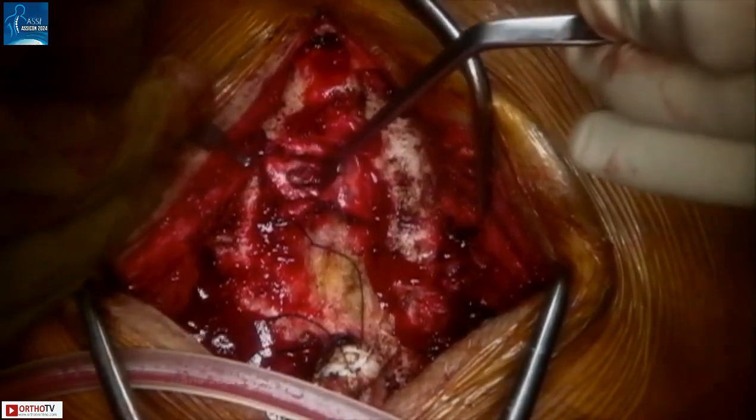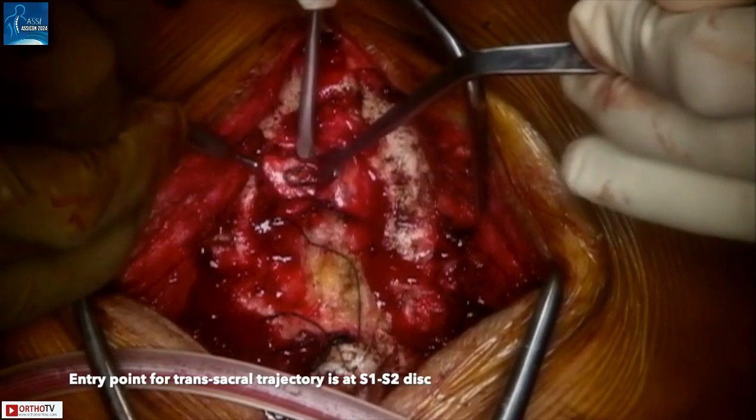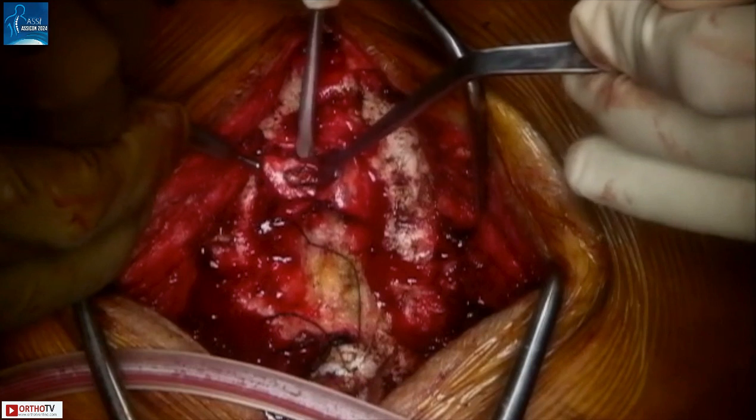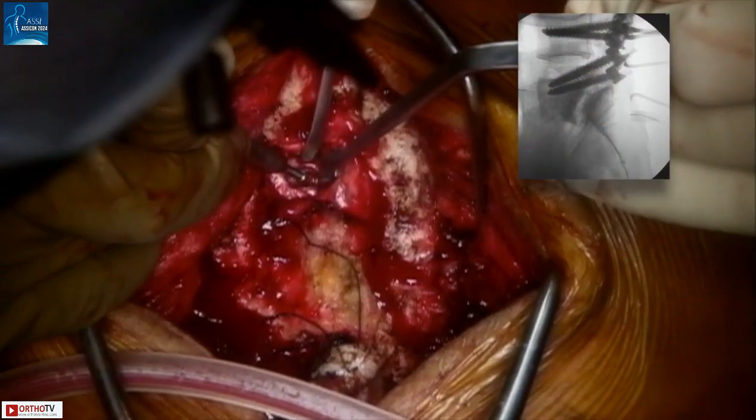Now you can see the area between the S1 and S2 nerve roots. The dural sac is retracted medially using a Derico nerve root retractor, and the S2 nerve root is retracted caudally using a Penfield 4. The entry point is the S1-S2 disc, easily identified on lateral fluoroscopic projection using a Penfield 4. The entry point is slightly off-center and not exactly in the midline so as to prevent excessive retraction of the dural sac. A close watch is kept on free-running EMG monitoring.